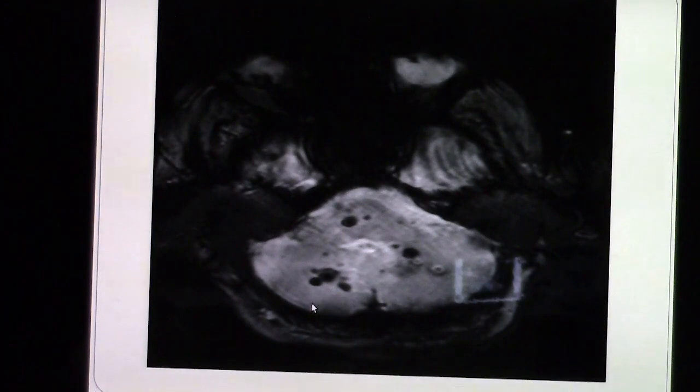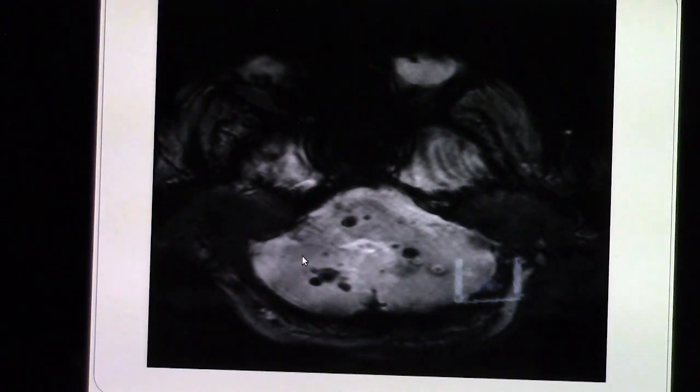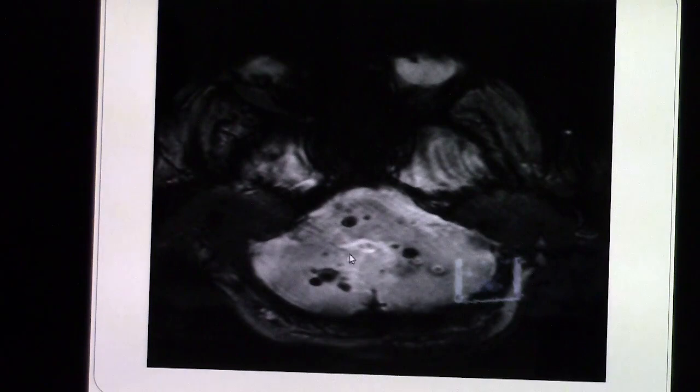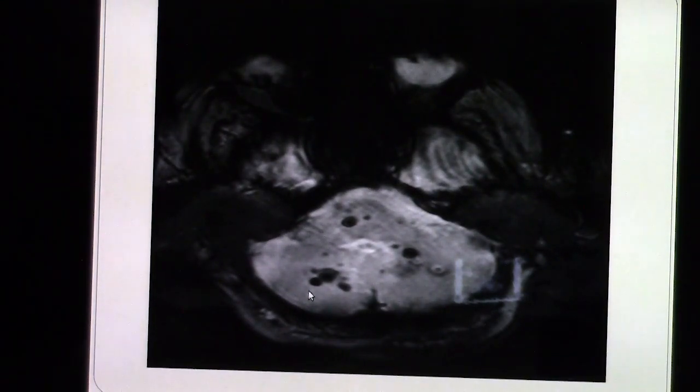There is also a more advanced cut called susceptibility-weighted imaging, or SWI, which is claimed to be even more sensitive for diagnosing bleeding. Dark spots on SWI indicate bleeding regardless of whether it is chronic or acute. As a rule of thumb: if it is dark in T2 and bright in T1, it is bleeding until proven otherwise.